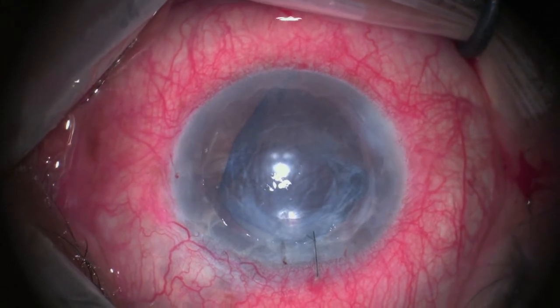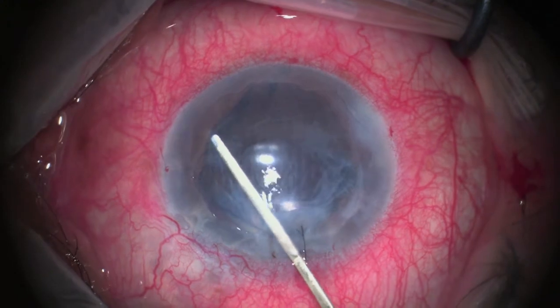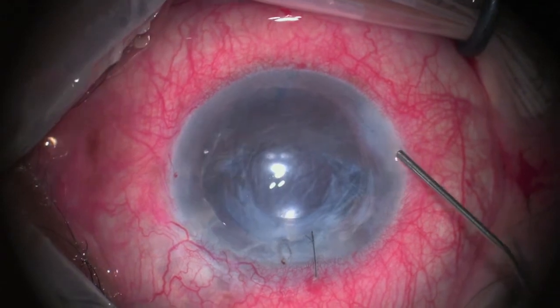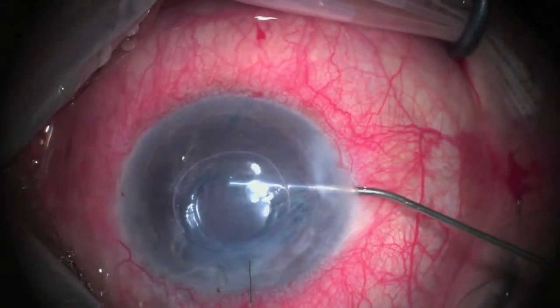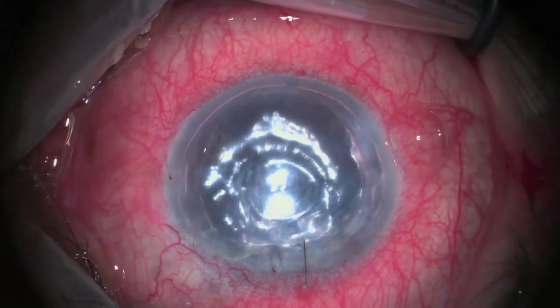Now I am unfolding the last part of the folded graft, then forming the anterior chamber a little bit to allow the introduction of the air injection cannula to the center of the anterior chamber, followed by full anterior chamber air injection.